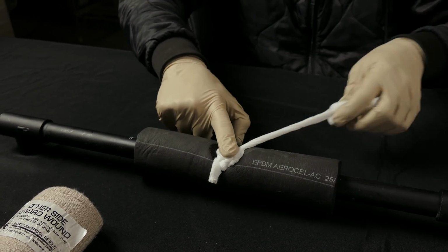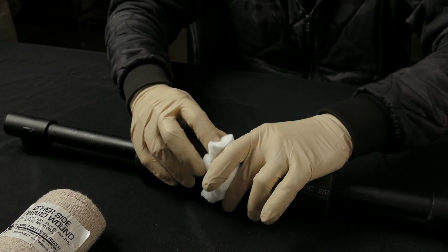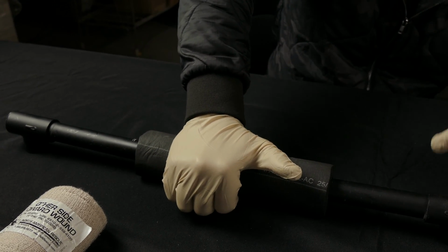Okay, so it's sticking above the skin a little bit, and I'm gonna just take the rest of my gauze and I'm gonna place it directly on top. So now the biggest area right here is where my bleeding is. Hold firm pressure down on that for several minutes, okay? This is giving it time to clot off.